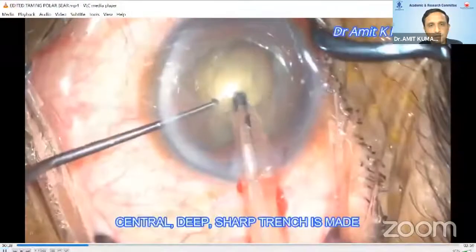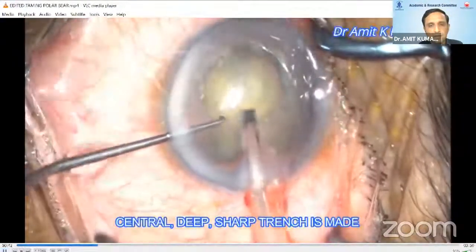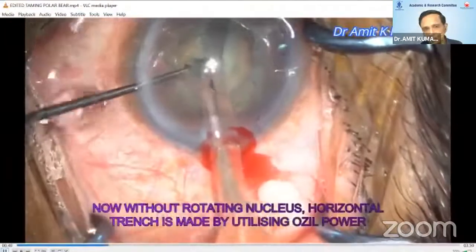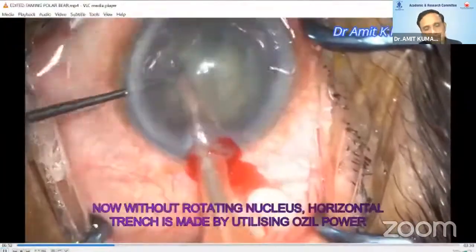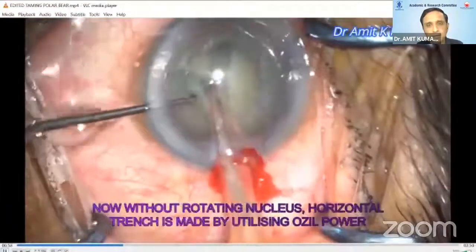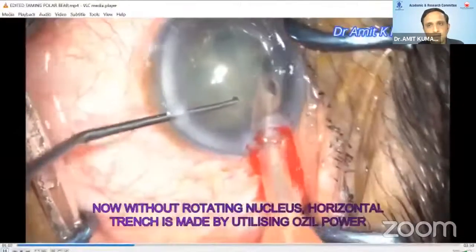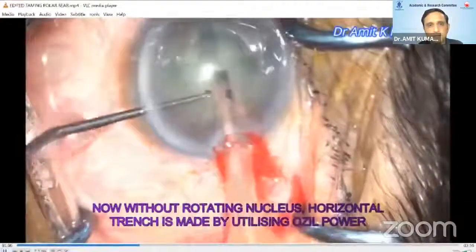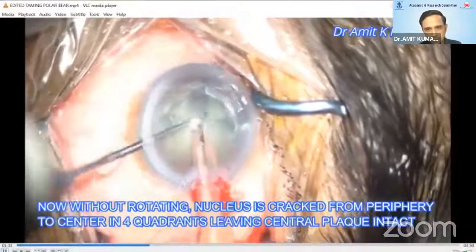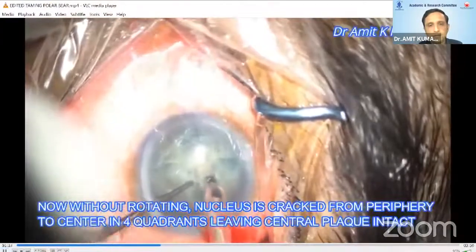Now, a small central deep trench is made as usual, and then without rotating the nucleus, using torsional Ozil power, a horizontal trench is made exactly perpendicular to the original vertical trench so as to make a plus sign. But here we don't have to rotate the nucleus. We are using the torsional power to make this horizontal trench.